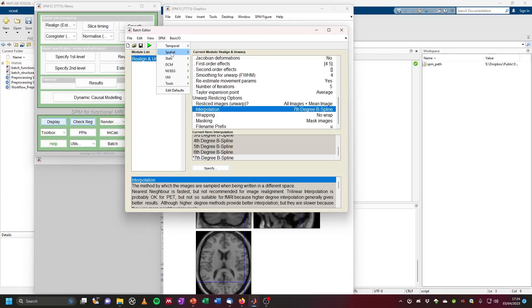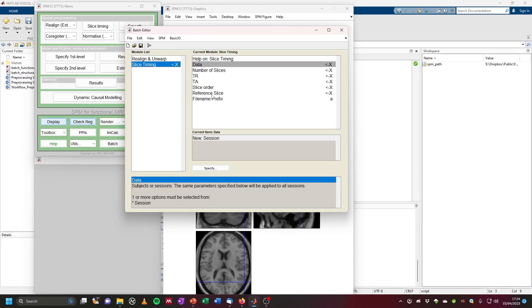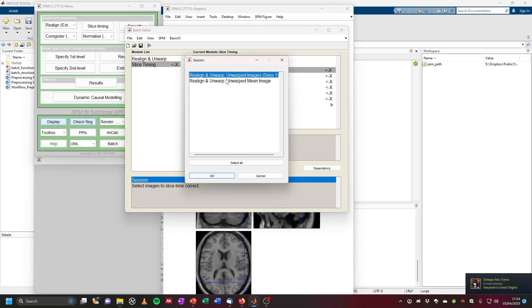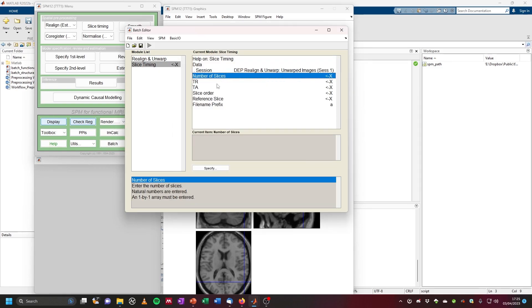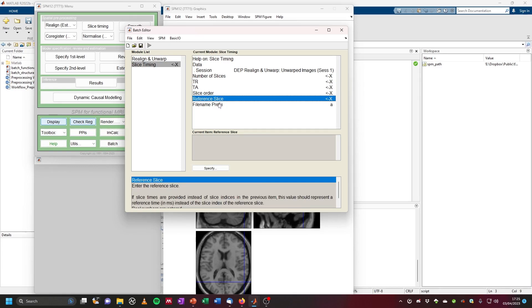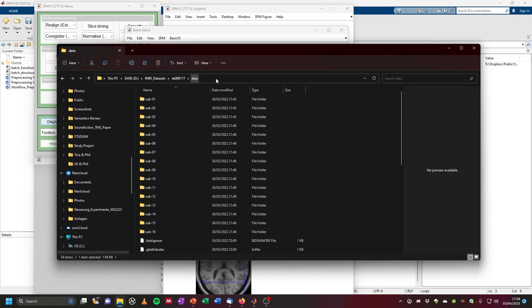As the next step, we can optionally perform slice timing correction. For this, click on SPM, then 'Temporal', then 'Slice Timing' — this is a temporal preprocessing feature. Then click on 'Data', 'New Session', and as the session we can use the dependency — right-click 'Dependency' and then choose our unwarped images from session one. We need to input certain information such as number of slices, TR, TA, slice order, reference slice, and so on. These pieces of information are typically in an associated JSON file in your BIDS structure.